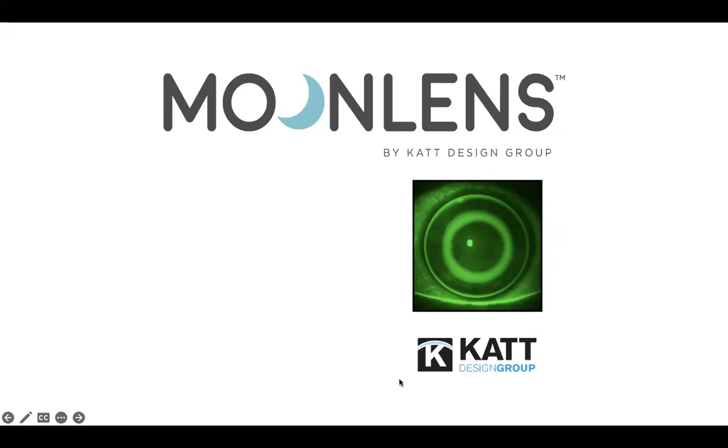So that's kind of where I was going. With a quarter of a diopter that isn't doing anything for the visual acuity, I wouldn't change. But if that quarter improved my vision by maybe 1 or 2 lines, then I will change the lens.